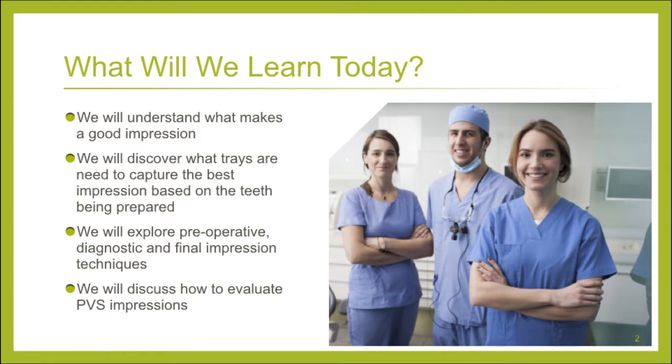Well, there's a couple of areas that we're going to touch on. We're going to talk about various types of impression material, but most importantly, the viscosities, understanding why we're using this product for this type of procedure to have you understand exactly what choices we have when it comes to those impression techniques. We're also going to talk about patient positioning.